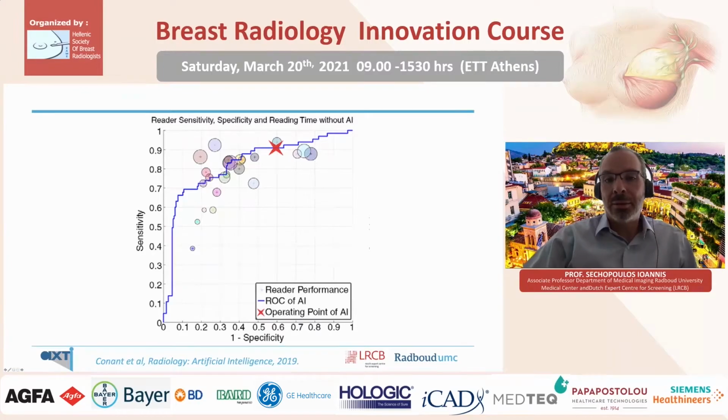So that would reduce the average reading time by half again. So now we're almost there. We're at 8.5 images on average per case. And maybe, again, if we push AI to its limits, then perhaps we can use it for pre-selection for no human reading of the very normal cases.